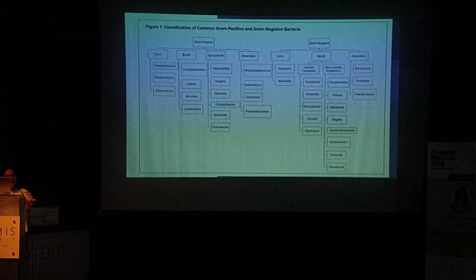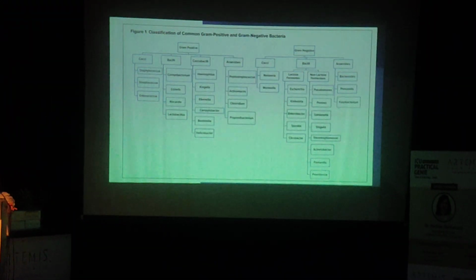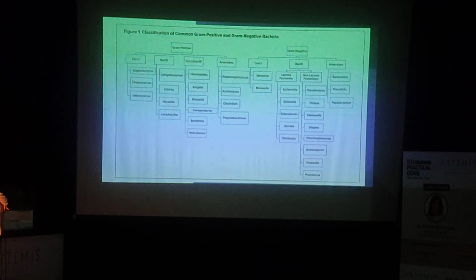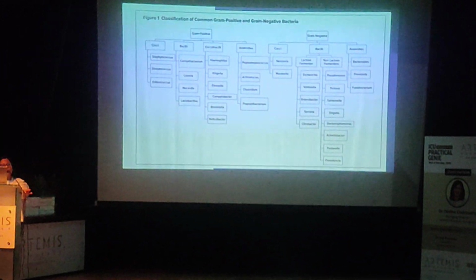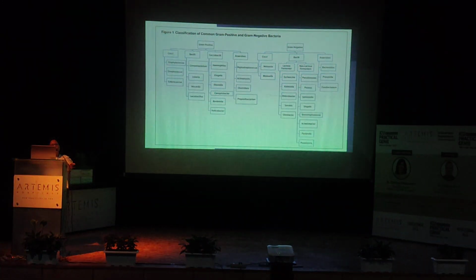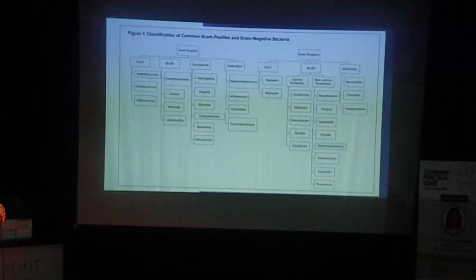These are either lactose fermenters or non-lactose fermenters. Among lactose fermenters, we get E. coli, Klebsiella, which we commonly get in our settings. And in non-lactose fermenters, it can be Pseudomonas, or if we get coccobacilli in that, it can be Acinetobacter. And gram negative anaerobes consist of Bacteroides and others.